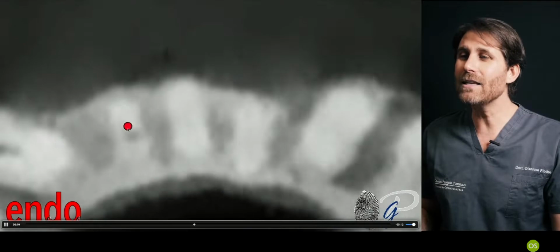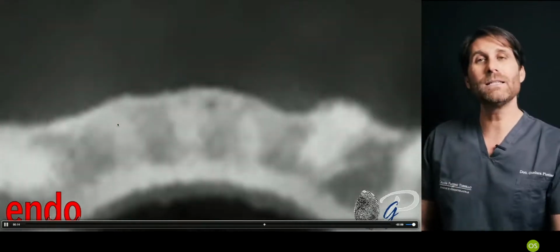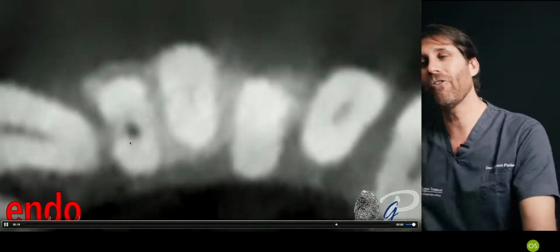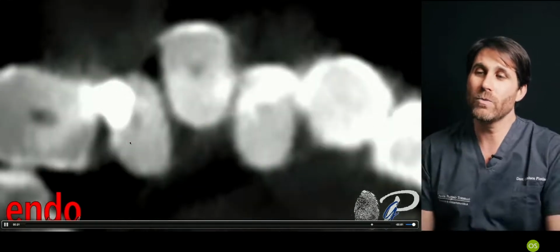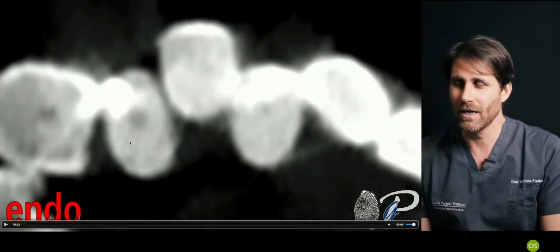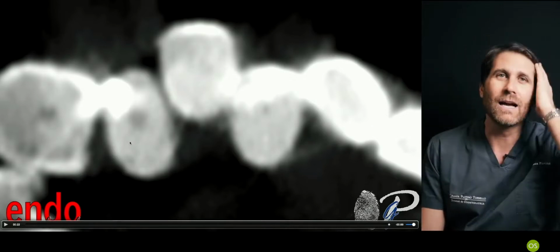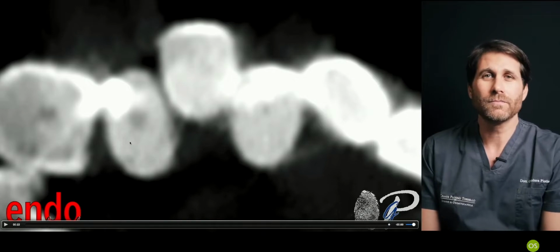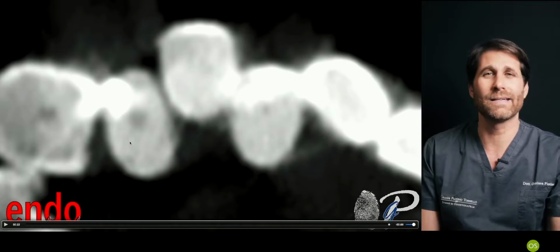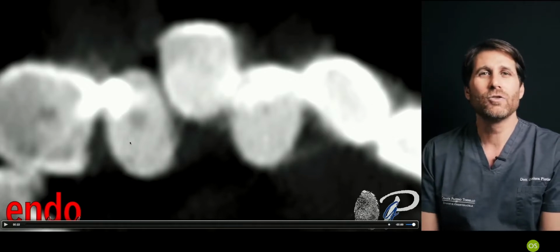We have to study it on the preoperative CBCT, because if the preoperative CBCT says we have just one canal, we can perform this access in which we have not a great visibility without impeding the cleaning of this canal. If we see on the CBCT that we have two canals, or if we have doubts clinically, we have to do the CBCT. If we have doubts clinically and we don't want to do CBCT, we have to open a bigger access cavity. So the strategy of the clinician should be decided.